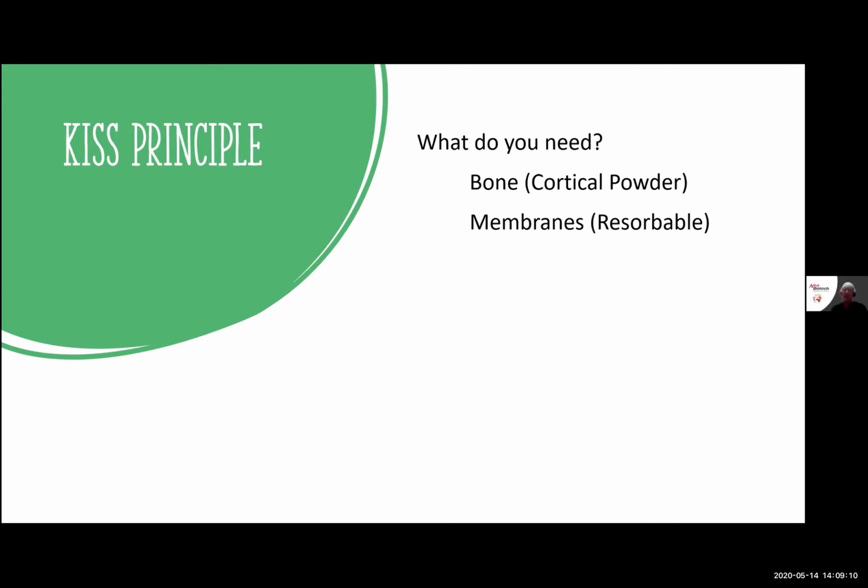Another is membrane, having a certain type of membranes available to put into place. Typically, the majority of the time I use a resorbable membrane, and I would say that's probably about 90% of the time I'm using a resorbable collagen type of membrane.